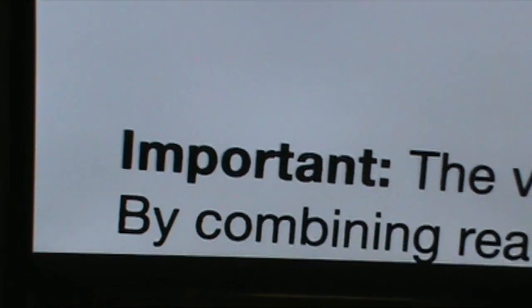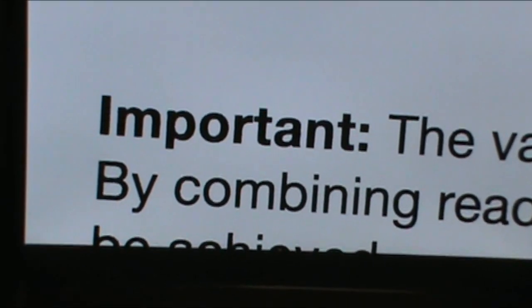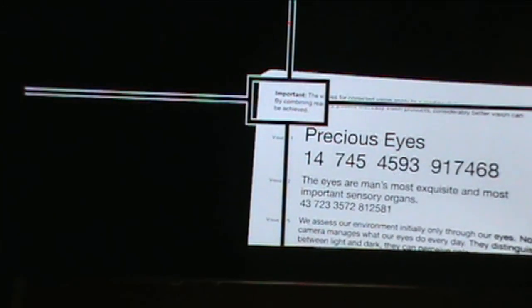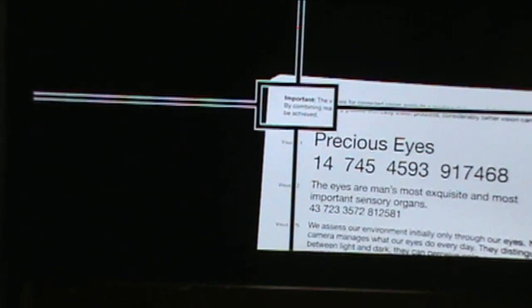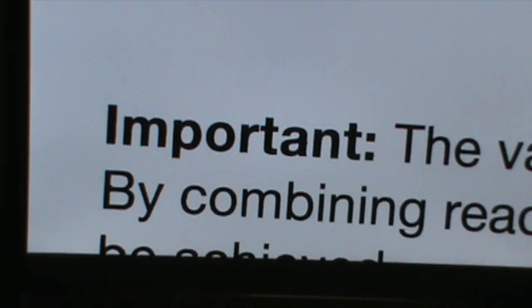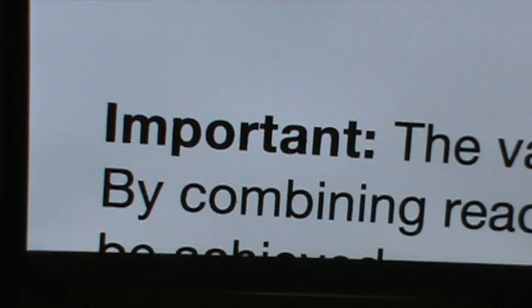We're back to where we need to start reading. And that's exactly where we wanted it too. It put that print right up where we need it, and it brought us back to the magnification level. So it's one key press, brings it down. One key press again, brings it back up again to the size that we had selected before. That's a nice feature as well.